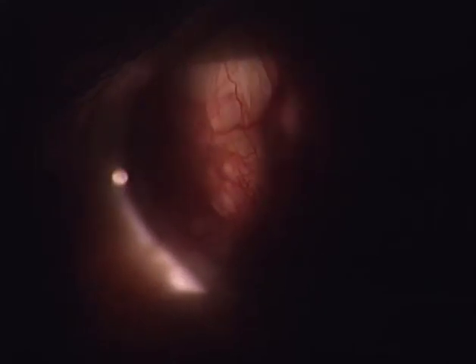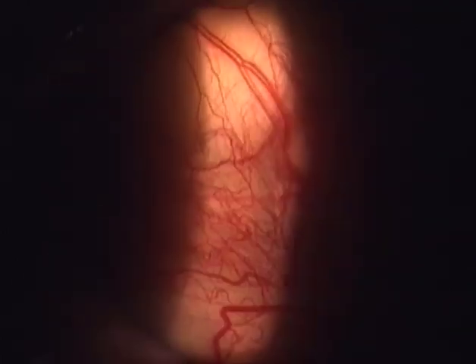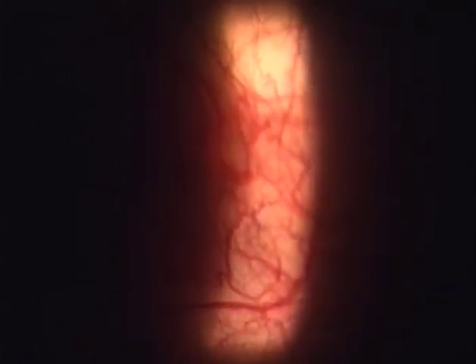When we look for a better background, for example, if we ask the patient to gaze laterally, the area in question is moved towards the angle, so by observing it tangentially, scleral reflection is reduced and we obtain a perfect dark background for the whitish nodules. If we examine the nodules of the bulbar conjunctiva in greater detail, we find no corona of capillaries, and the vessels are just running across them.